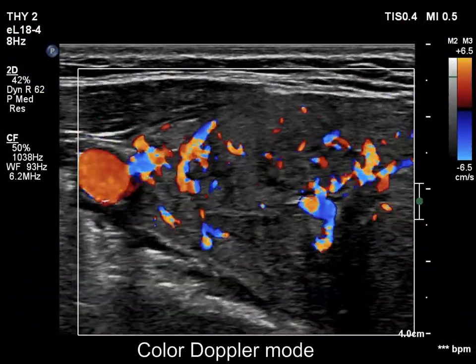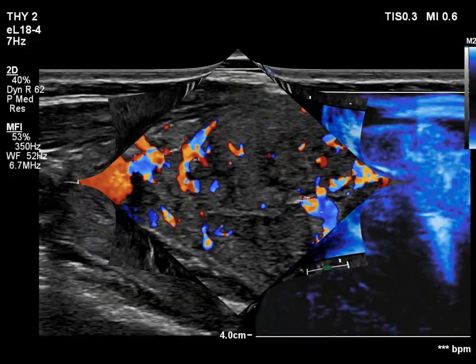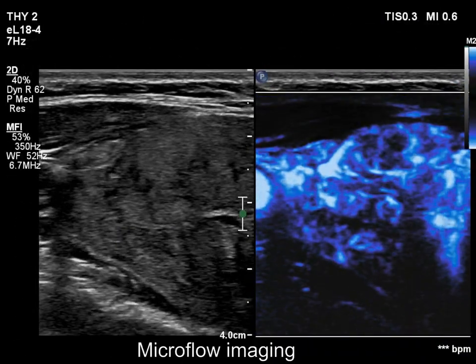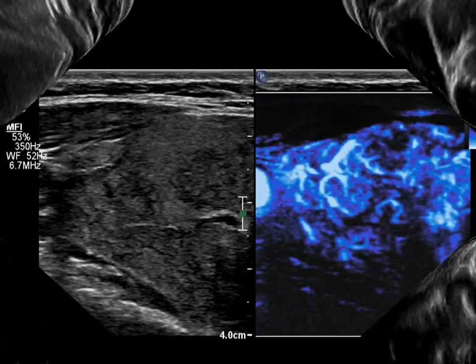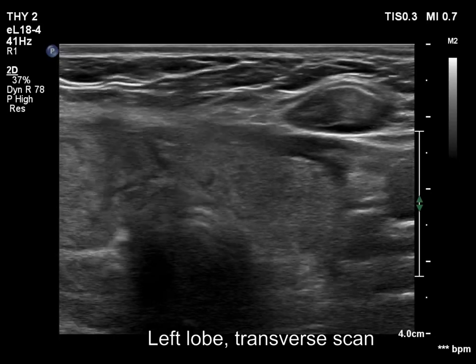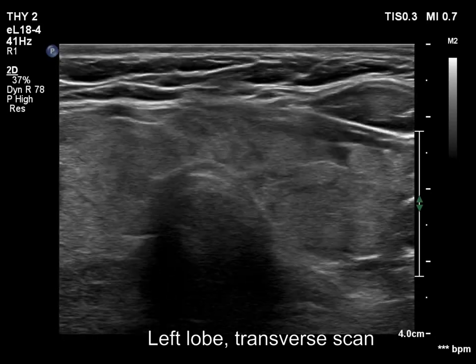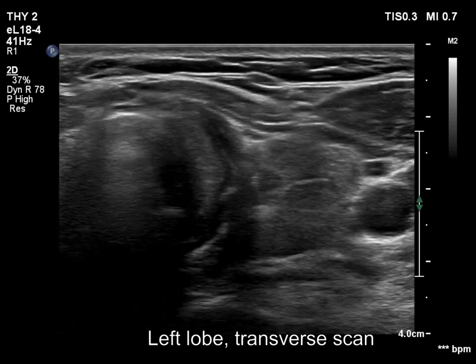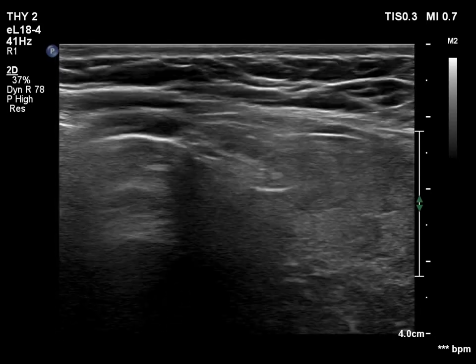Vascularity can be detected along the fibrous bands. The left lobe has a similar appearance.